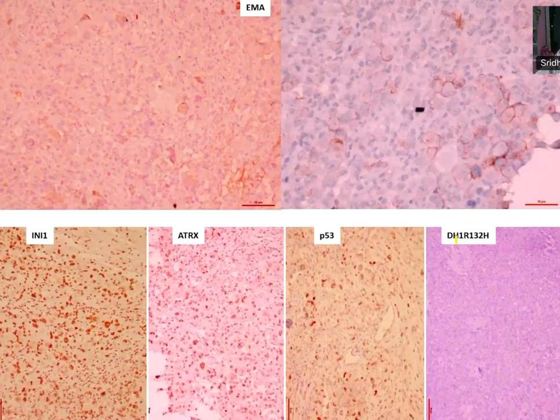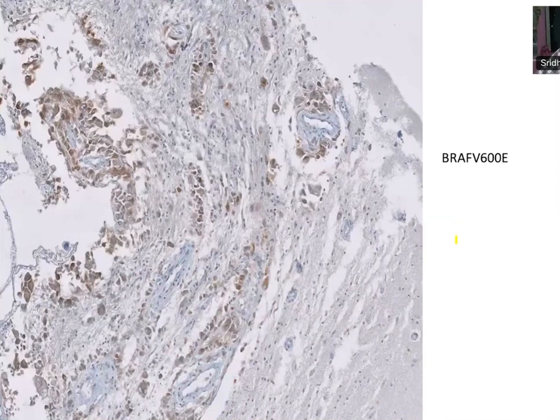Here you saw the tumor is uniform in appearance across the entire tumor, so your possibility of epithelioid glioblastoma is very high priority. Irrespective of that, epithelioid glioblastomas are predominantly BRAF V600 mutant, so you can ask for BRAF, which is also available for immunohistochemistry. Okay, so this is another immunohistochemistry for a mutant-specific BRAF. Okay, you demonstrated cytoplasmic positivity. You can see here. Yes.